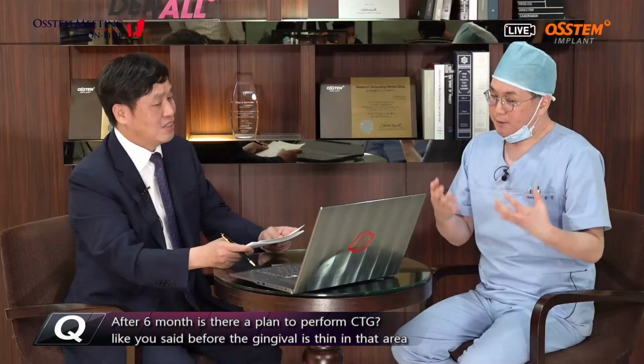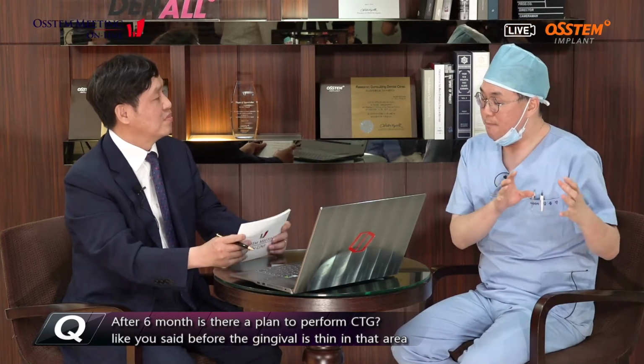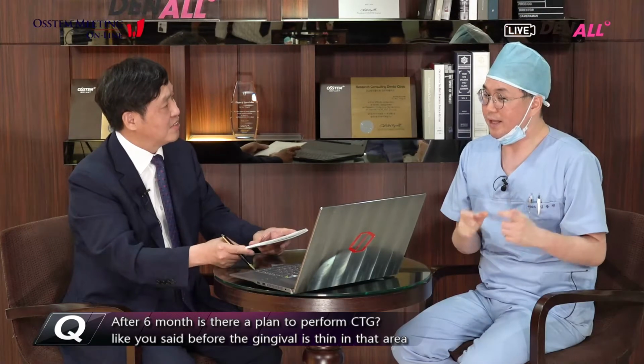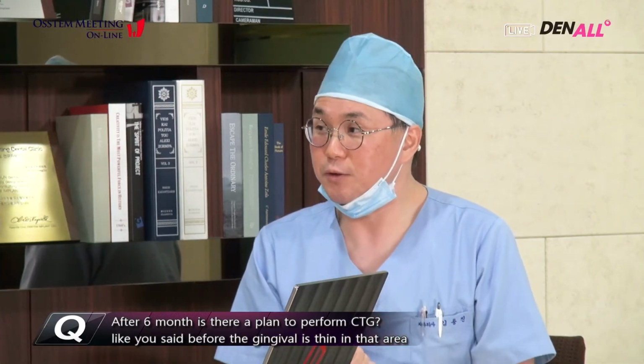After buccal flap advancement, coronal advancement of the buccal flap, the vestibule will be shallow, and then the amount of keratinized gingiva will be decreased. So according to the healing status, I will do vestibuloplasty with the apical portion of the flap along with a free gingival graft, but sometimes to change the gingival biotype, a connective tissue graft will be done during the second stage surgery. Yeah, I see. Maybe you can do the FGG or CTG. Maybe the second topic is FGG, so we will discuss that.